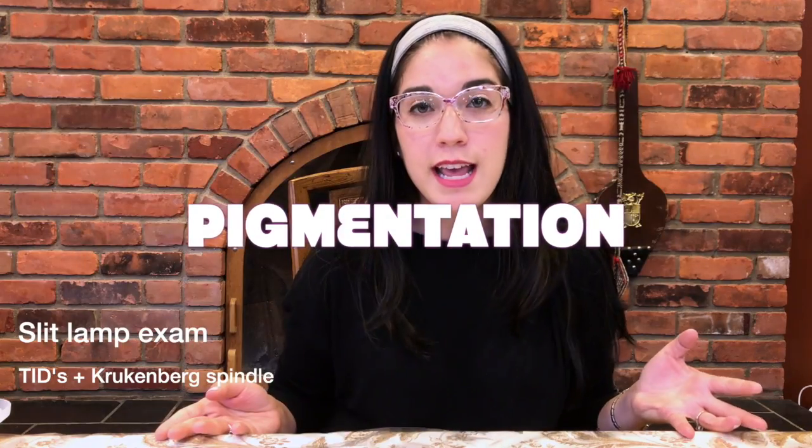For your slit lamp exam, you're basically looking for pigmentation, and this can be manifest in different ways in different patients who have pigmentary dispersion syndrome. The first area that you have to look is the iris itself. What are you looking for? Transillumination defects at the mid-peripheral portion.